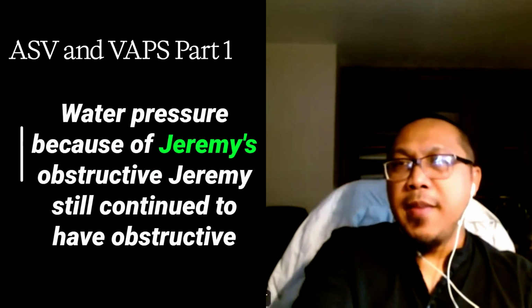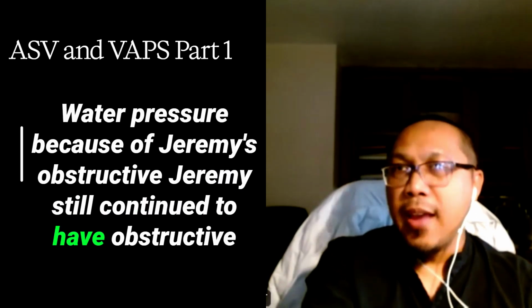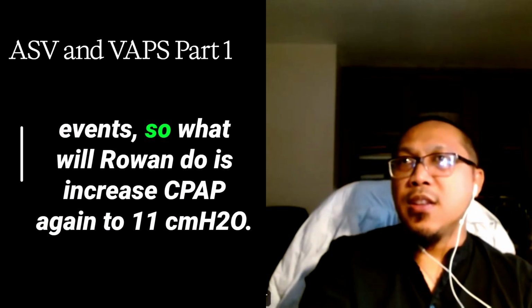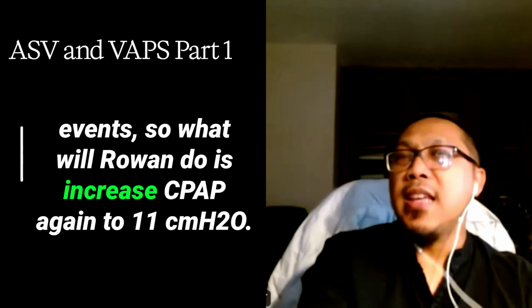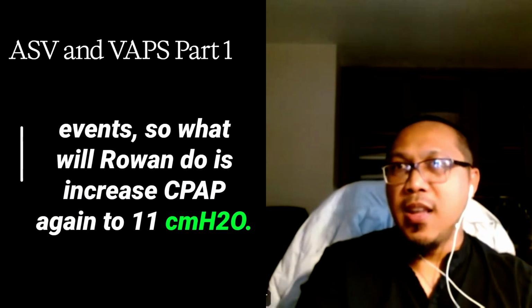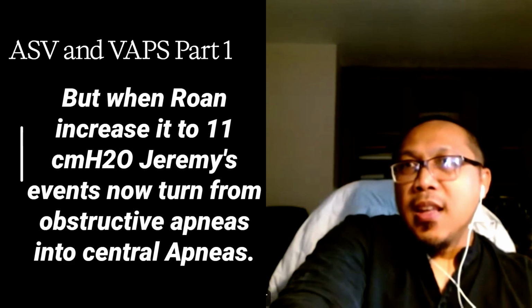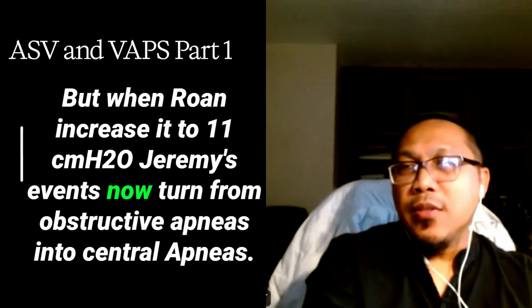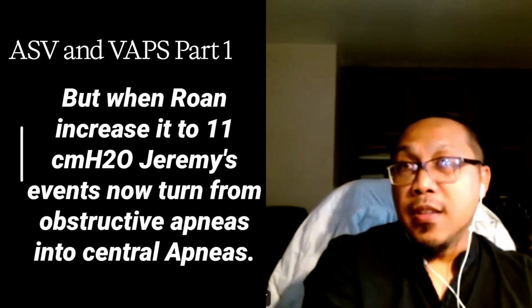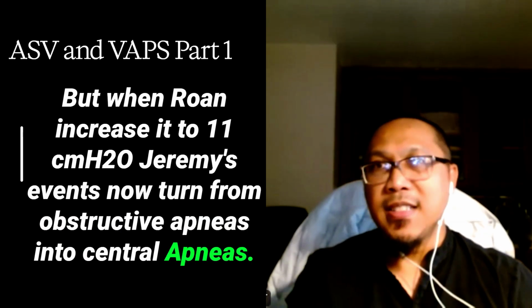Jeremy still continued to have obstructive events. So what Rowan will do is increase CPAP again to 11 centimeters of water pressure. But when Rowan increased it to 11, Jeremy's events now turn from obstructive apneas into central apneas.